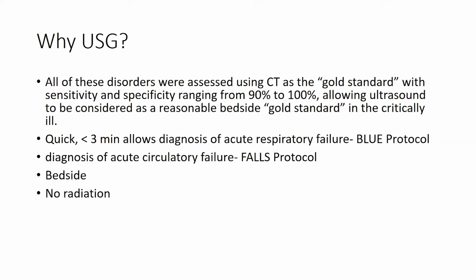In your critically ill patients, when you cannot shift them for a CT scan or other modalities of investigation, ultrasound is very easy, and most importantly, you don't have to shift the patient. It's a bedside assessment available. In a very quick time, less than 3 minutes, you can assess the cause and reach a diagnosis as to why the patient is having respiratory failure.